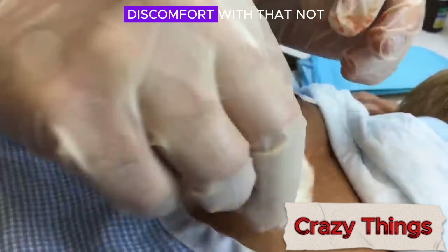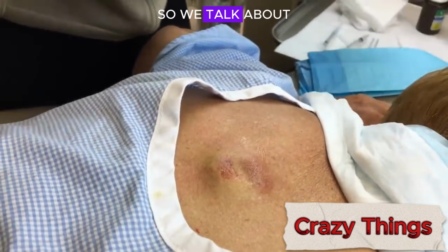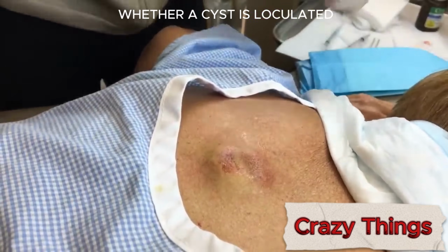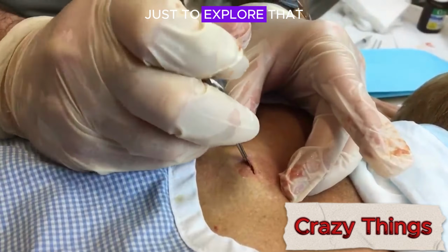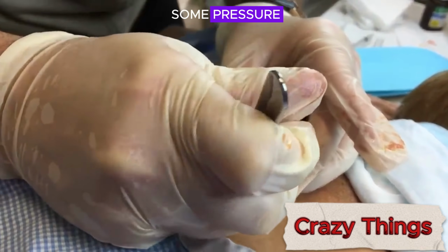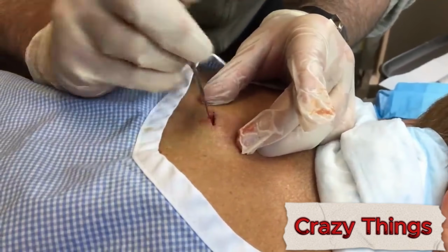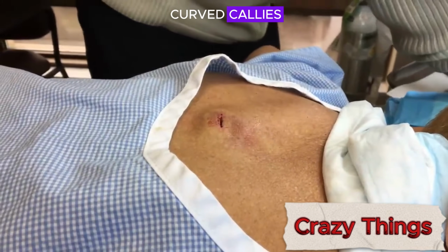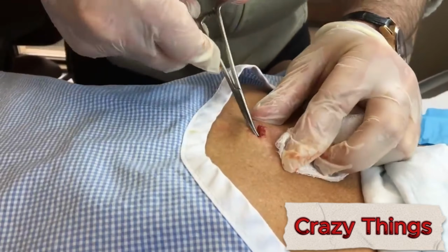Not having too much discomfort with that? Not too bad. So with this one, we talk about whether a cyst is loculated. I want to use the number 11 blade just to explore. I can feel that right there, but... Yeah, you'll feel some pressure. Okay. And then I use curved Kelly's, which is this instrument here.